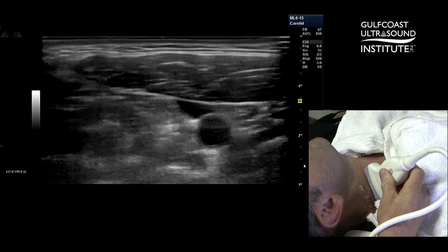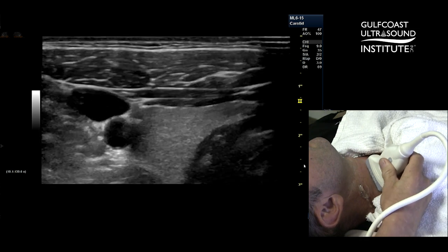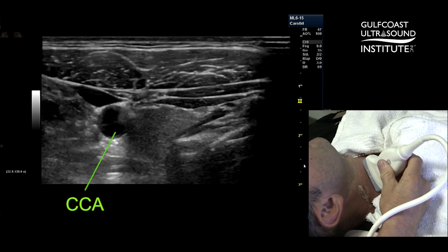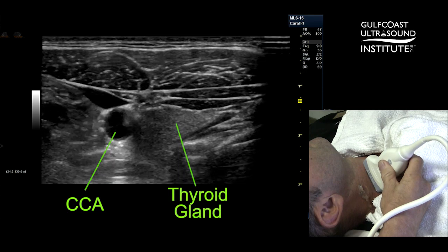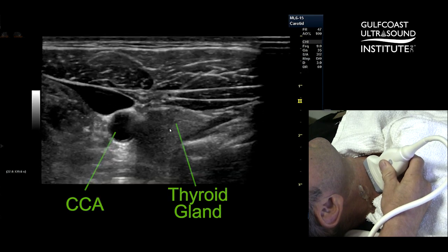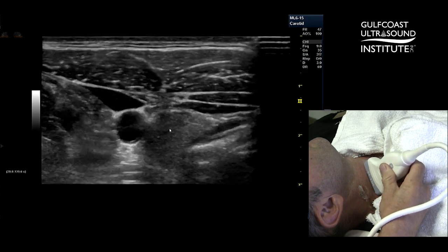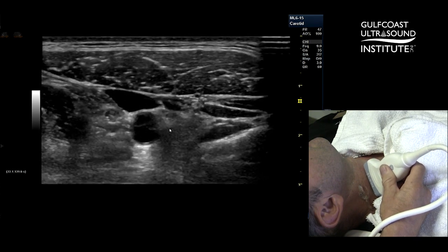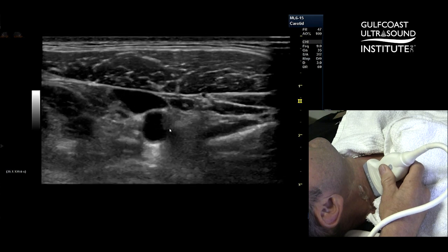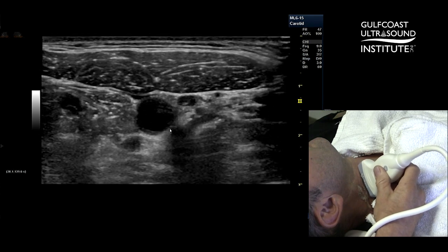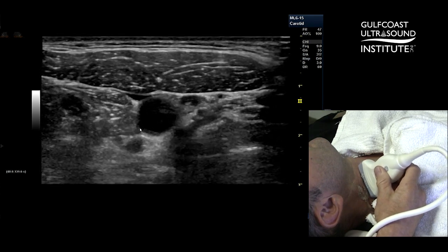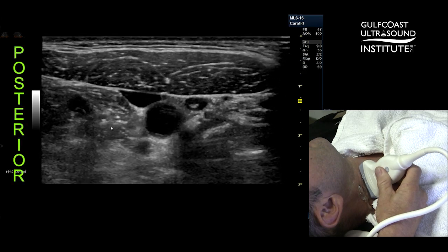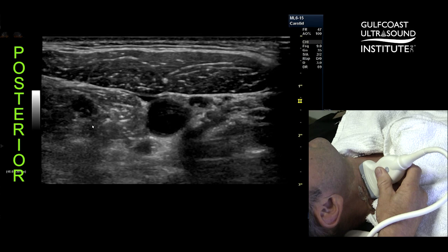First off, there's a series of steps. I start out in a transverse view and identify the common carotid artery. I position the thyroid gland to the right of the common carotid artery, as we see here in the image. This corresponds to having the notch on the transducer essentially pointed towards the shoulder or towards the head or the pillow. In this anatomical situation, when we're coming in from the side, to the left of the screen is actually posterior.